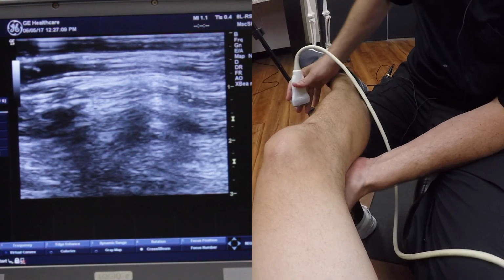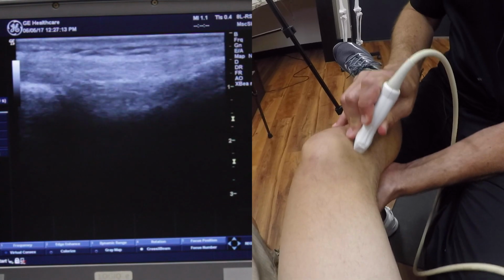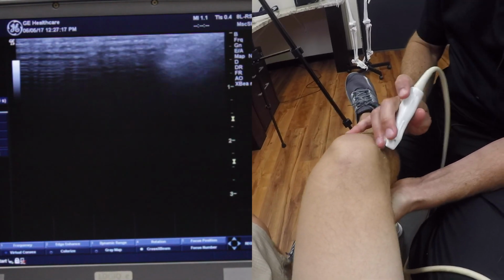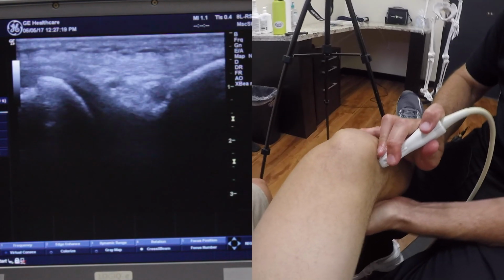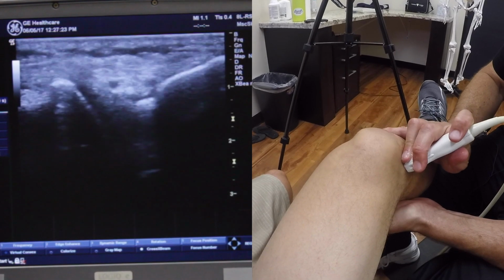Again, the advantage of ultrasound is we're bending things and moving things around. So now we've looked at... Nice that it doesn't hurt and you just get to... Yeah, definitely. If you do this right here... You don't have to gown up or anything. No gowning up. Yeah, right on the spot.